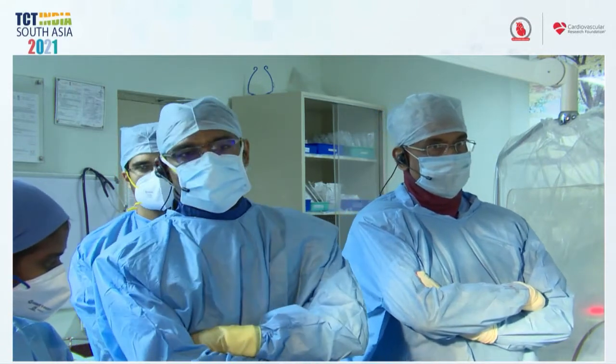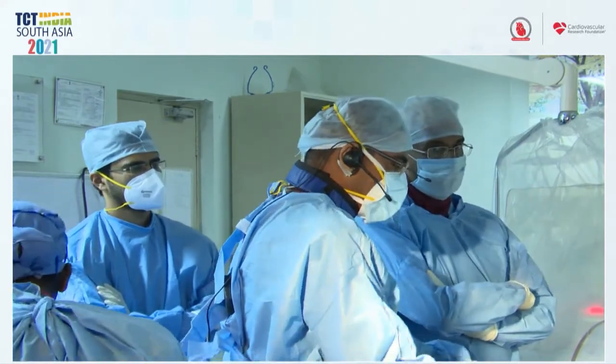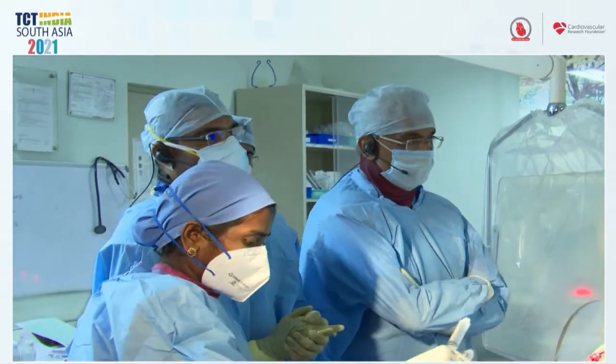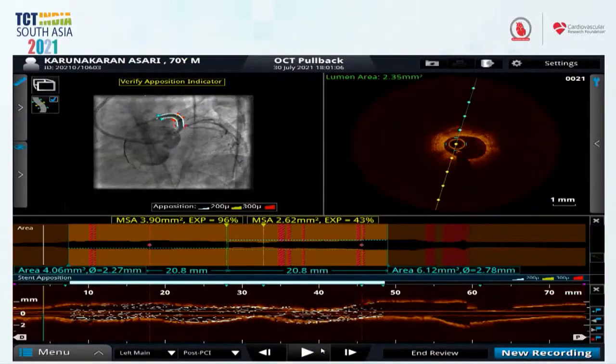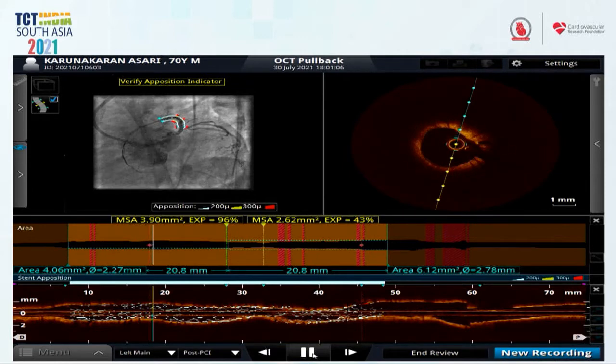Quickly get it, it is getting late. Okay, so Jihad, what is your practice? Do you do an OCT if you suspect that the ostial LAD stent comes back into the left main, to decide whether to open into the LCX before putting the second stent? I would typically have done all of this using IVUS. But I think there's an advantage using OCT. Look at the quality of the images comparatively. It's just so much easier to see. So if you can afford to use both, obviously there's a lot of advantage there. I am a firm believer that in the ostial left main, IVUS is the superior modality.